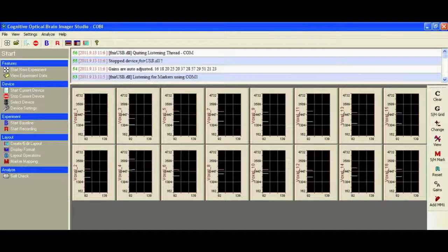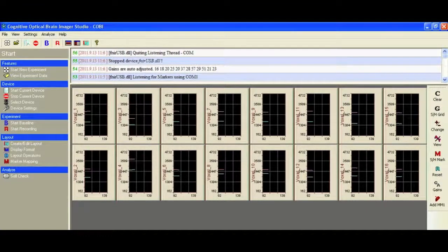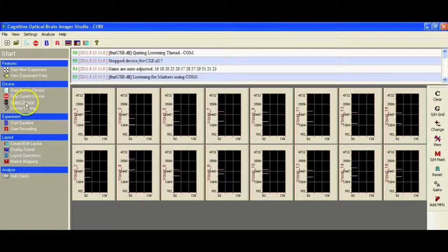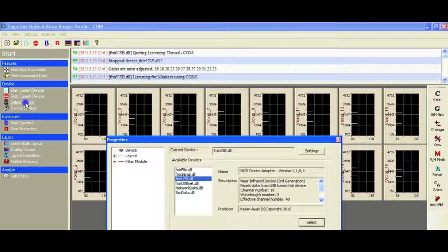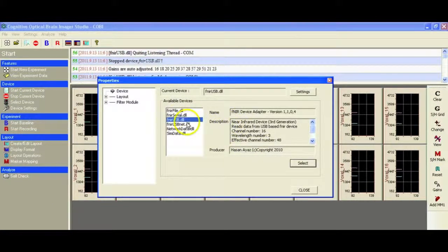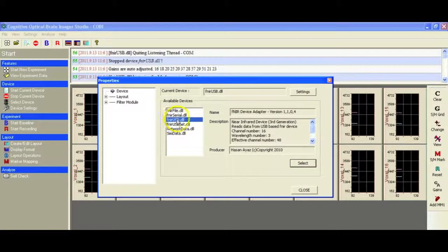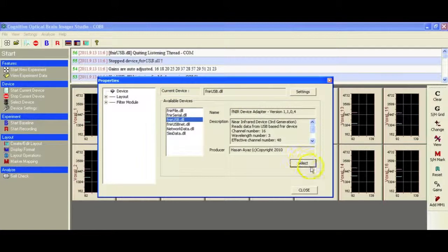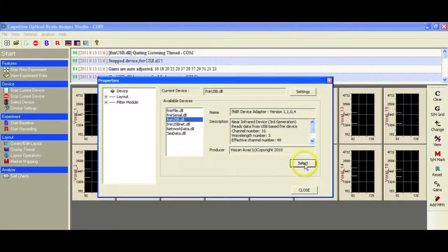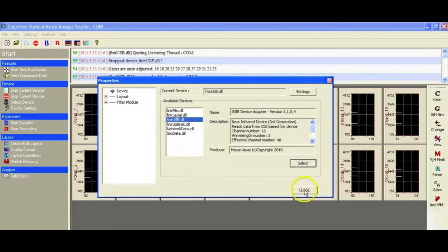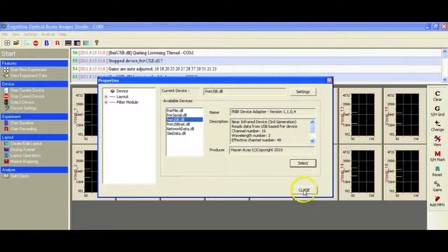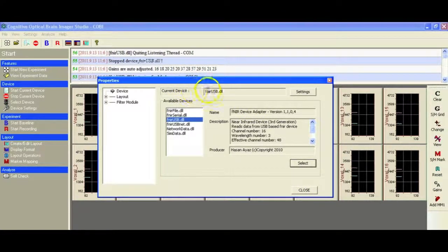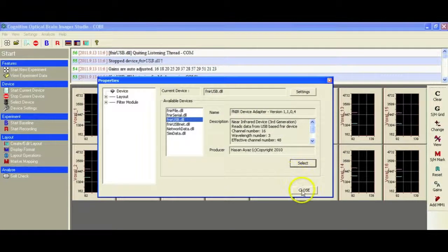The first thing you need to do when you launch the software is go in and select your device. We need to select the appropriate device, which is FNIR usb.dll, and that is selected from the list by clicking on the select button and then closing out. At the top you should see current device FNIR usb.dll.